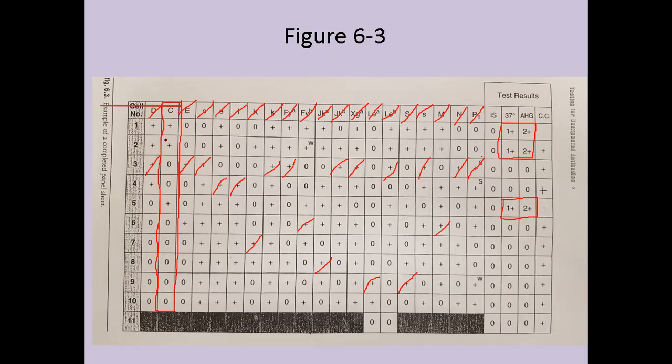We look at cell 2, C antigen is present and patient reacted. The next 2 lacked C antigen and patient did not react with those cells. And we see 5, C antigen is present and patient did react. And then the next 5 cells are negative for C antigen and patient did not react. So that is what we call a perfect pattern match.